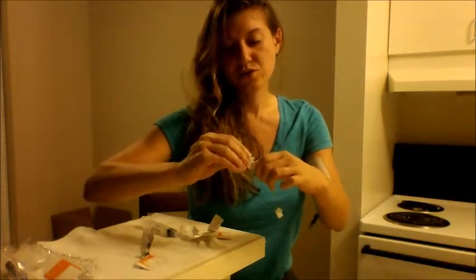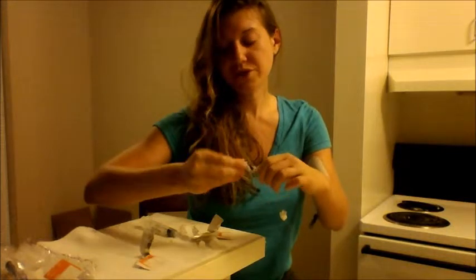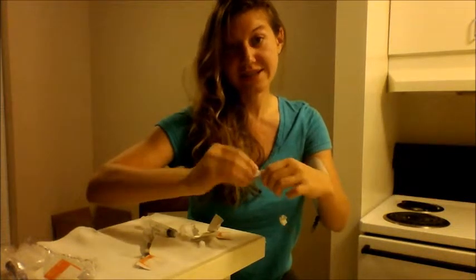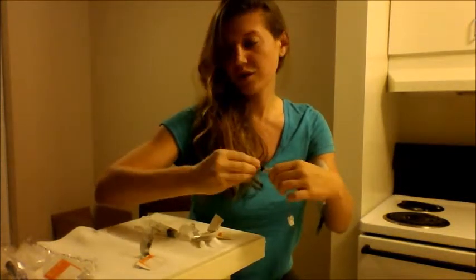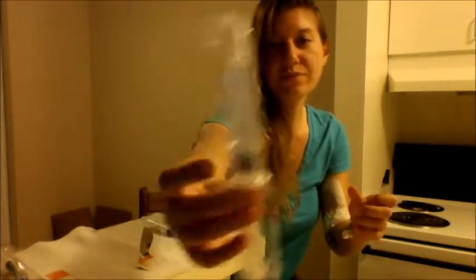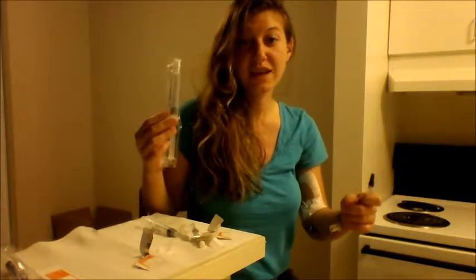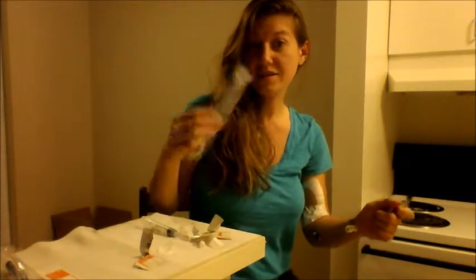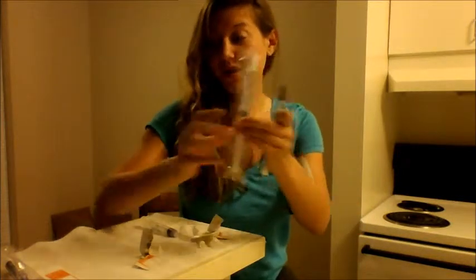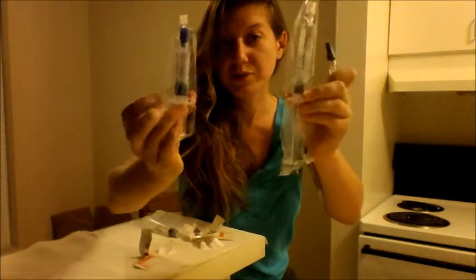You can prep your syringes before — I didn't, so I can show you. This is your saline solution. We are doing the second half of SASH, so the order is: saline, antibiotic, then saline, heparin, saline, heparin — the blue one.